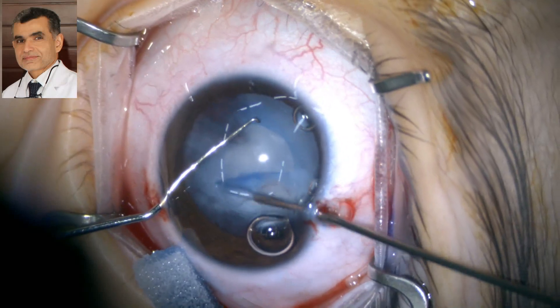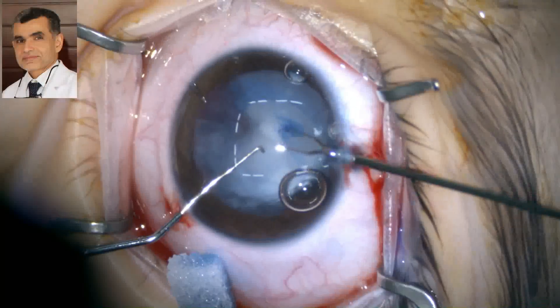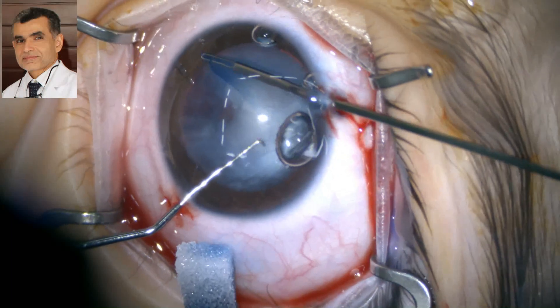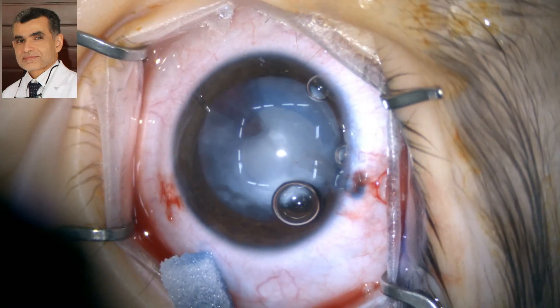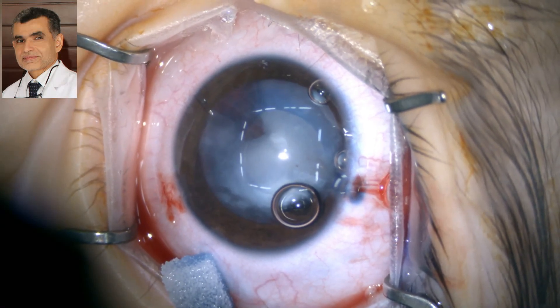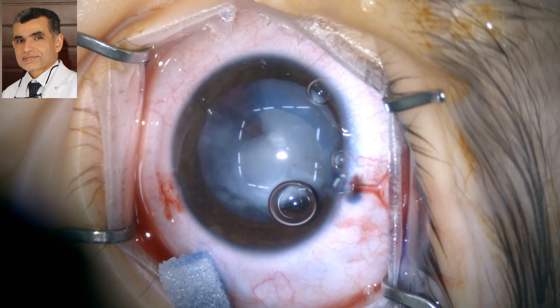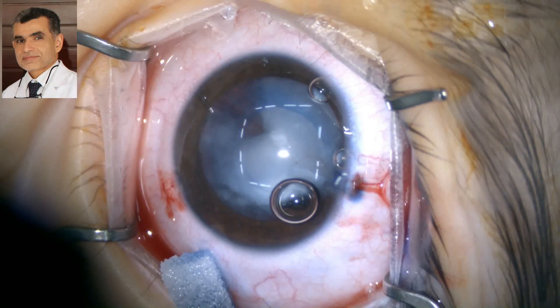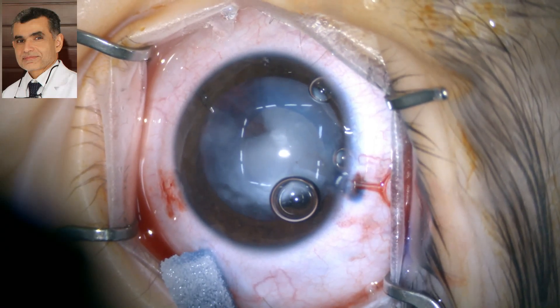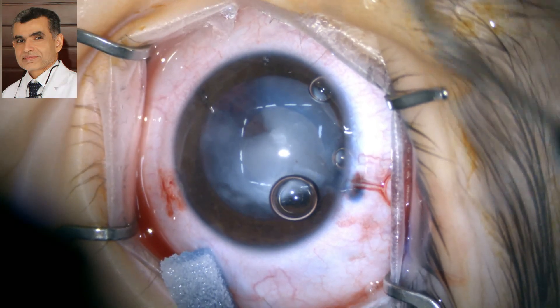It is very controllable and we started; we can even switch hands. Unlike in adults, the elasticity of the capsule in children makes it challenging to complete a round, controlled capsular access. But this process — using these forceps — makes it much easier.